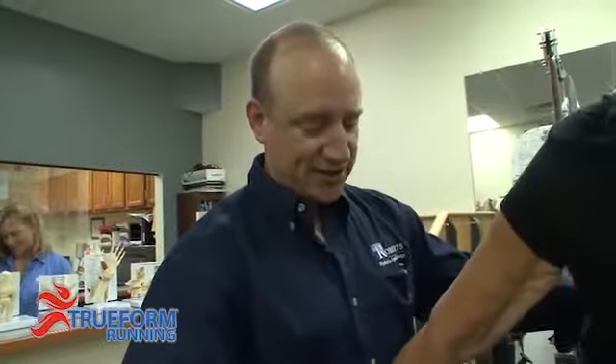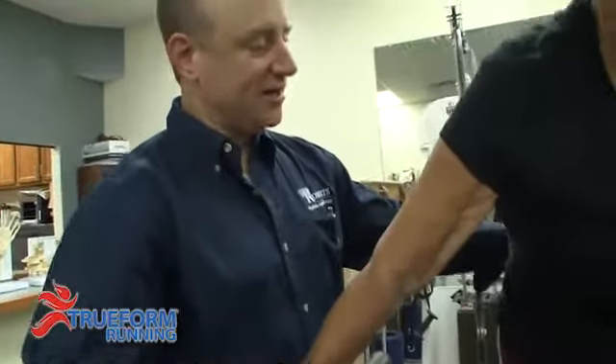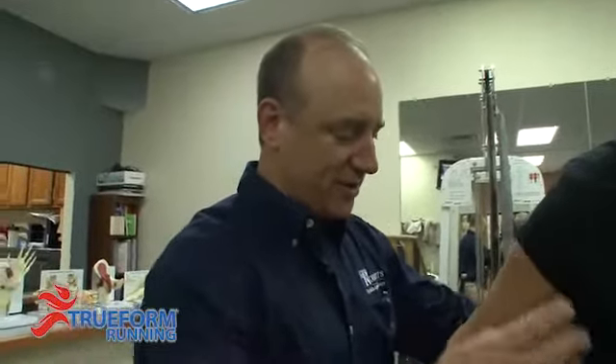What I see here: I see a good foot strike, I see good balance, I see the back and the spine in good alignment, pelvis in good alignment. Now Terry's starting to lose a little bit — I'm going to have you come back a little bit. Good, there you go.